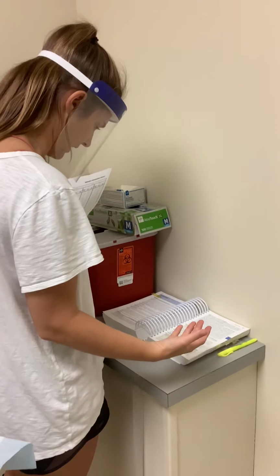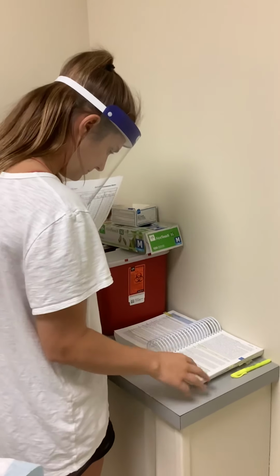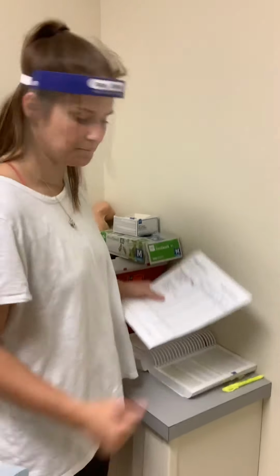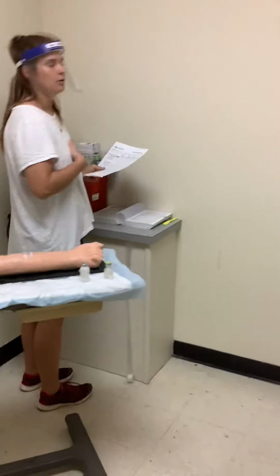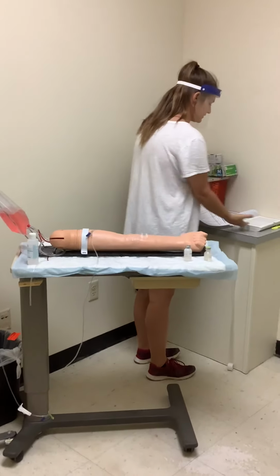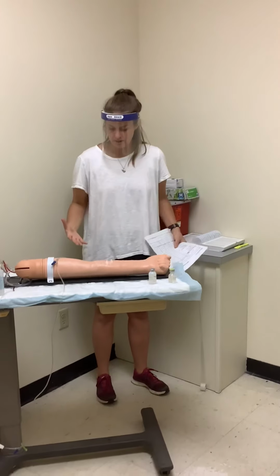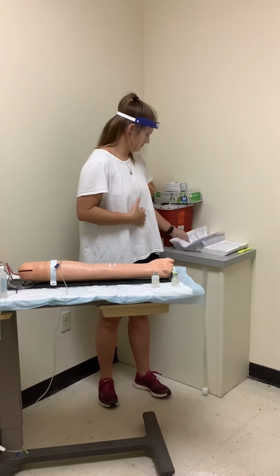For precautions, I am checking for any excessive diuresis. I am monitoring the blood pressure frequently, and I'm checking for any electrolyte imbalances. I'm also checking to make sure that it is compatible with the primary solution already running, which is normal saline, and it is compatible, and I know that because my book has told me it is compatible. So at this point, I can get all of my equipment together and get it ready.